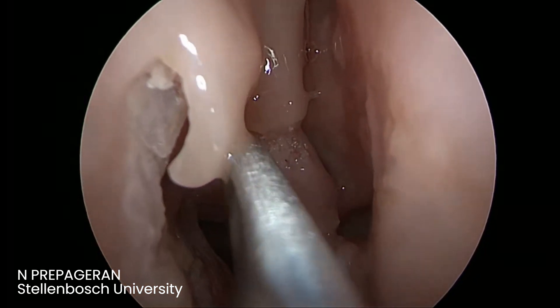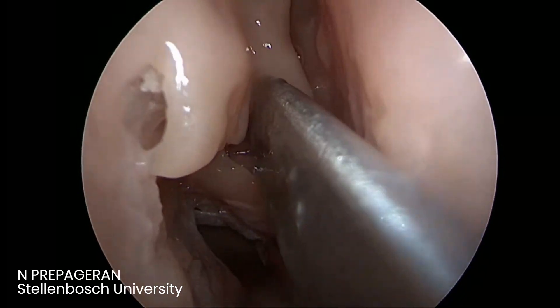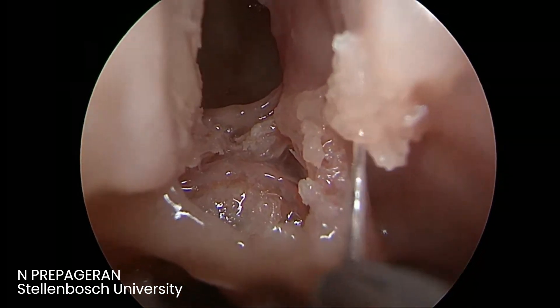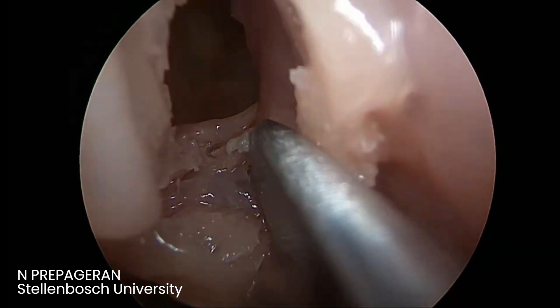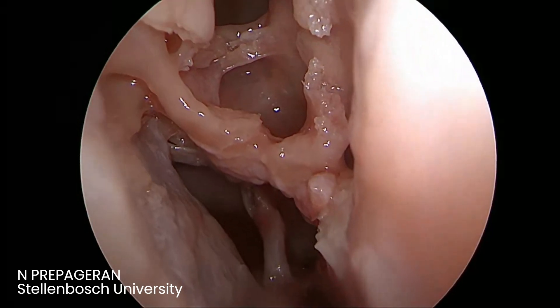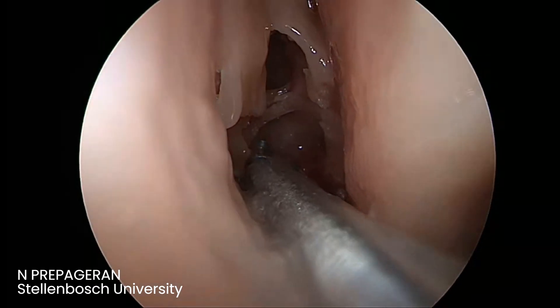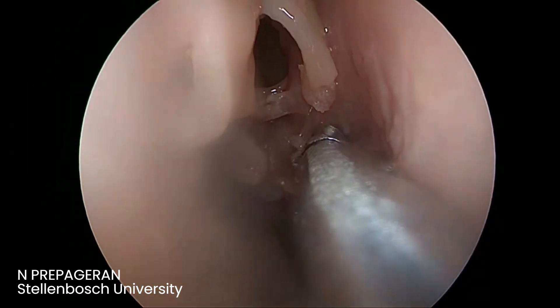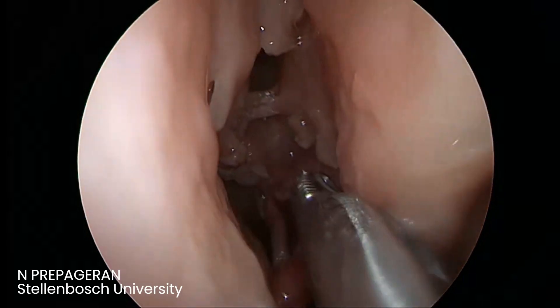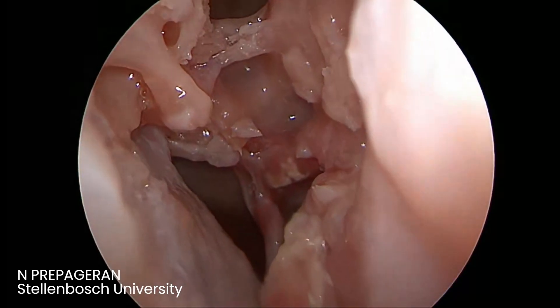All we need to do is go into the bulla itself. Look for air cells. First, probably a retro bulla air cell — now we are inside the anterior ethmoid. The bulla air cell, the anterior ethmoid. The idea is to remove only what is required and preserve everything else; do not strip any mucociliary clearance. Can you see how small the ethmoids are? Gate number two has been removed — it's just a supra bulla air cell.